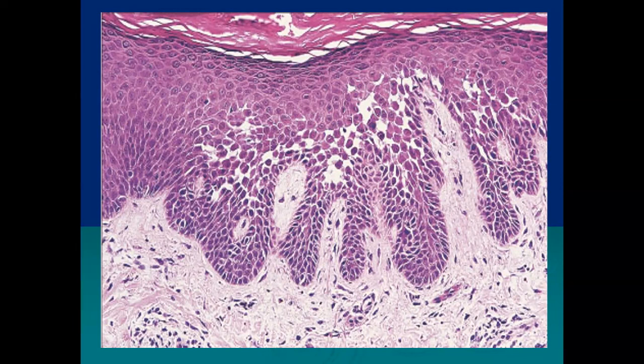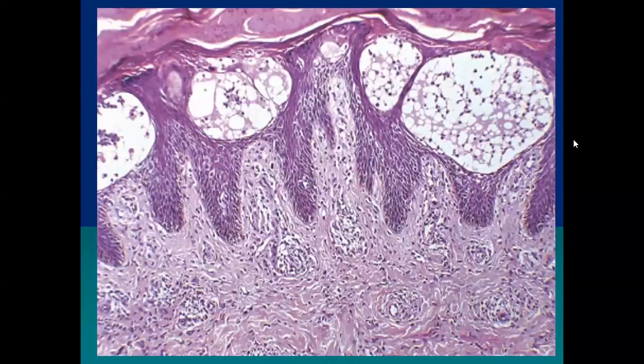Similarly, what we see in old ruins of a building, a few bricks are lost and a few bricks are intact.